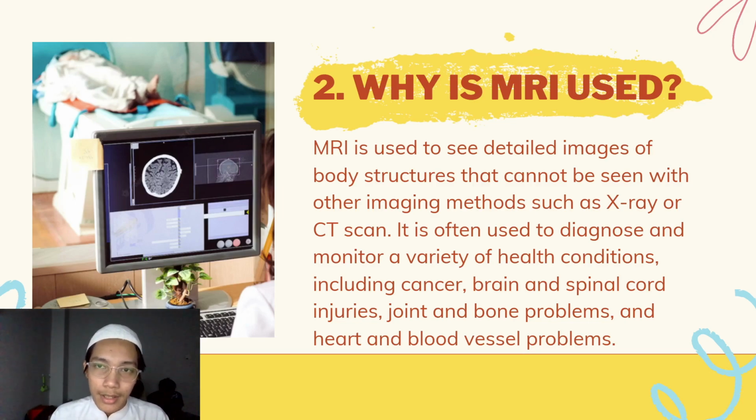The second thing is, MRI machines do not emit ionizing radiation like X-ray machines and CT scans. So for patients that are undergoing this imaging process repeatedly, and for long-term patients, they will be at less risk of contracting a disease that's related to the radiation, such as cancer and so on.